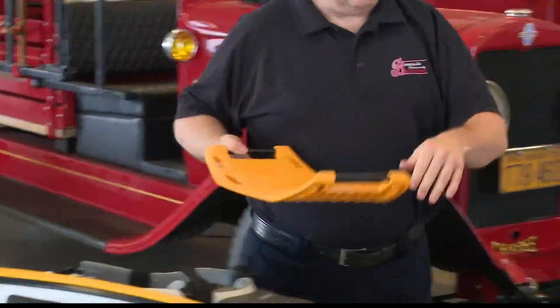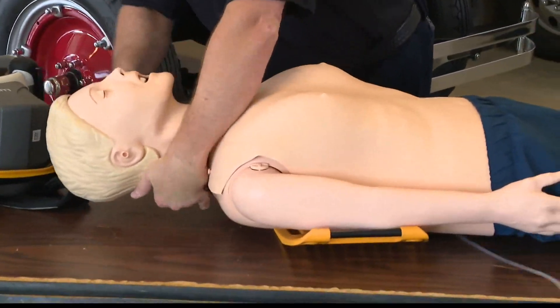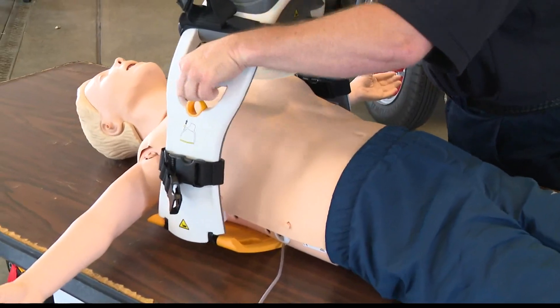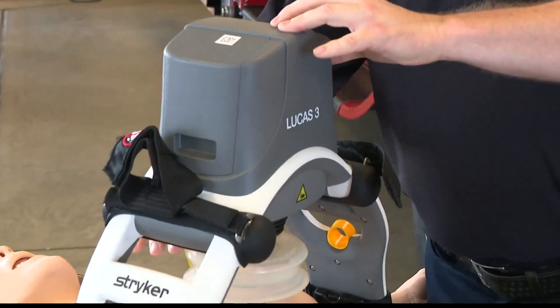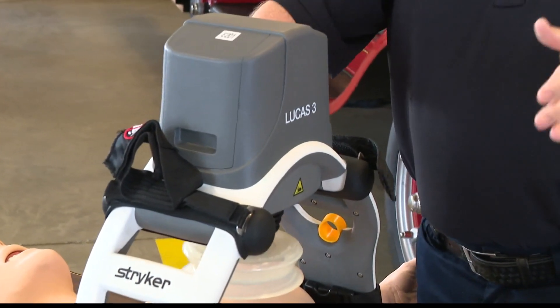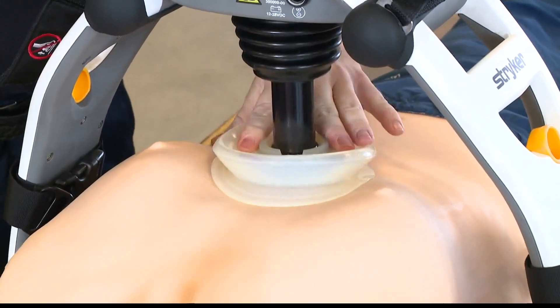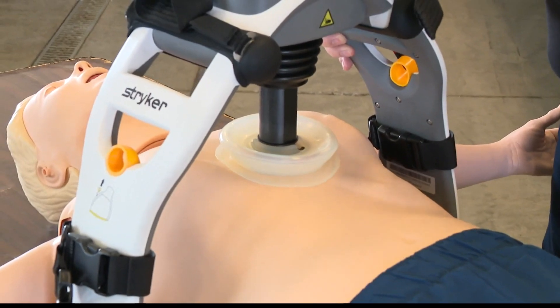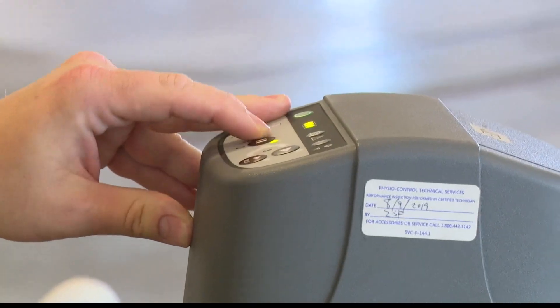We start with a back plate that provides a stable surface underneath the patient. Then we apply the device to the chest right under the armpits, turn it on. It's a simple one-two-three process to begin mechanical CPR. Bring the suction cup down so it sits just on the chest, make sure it's flush, and then you can start the device.